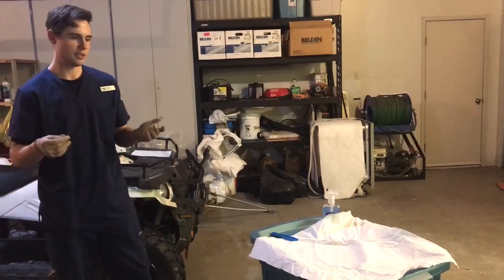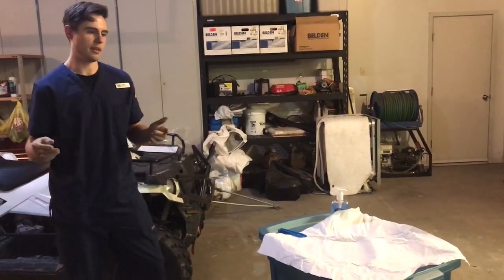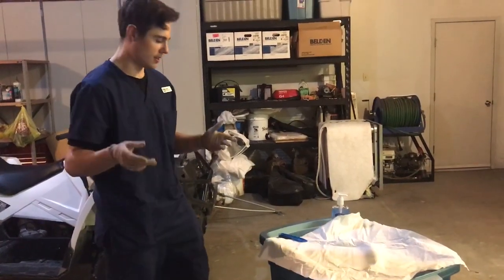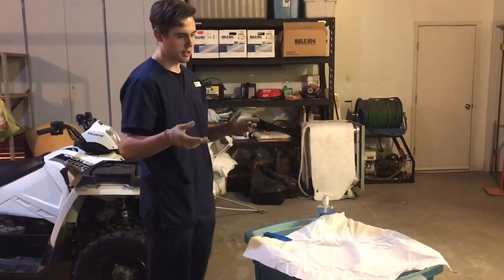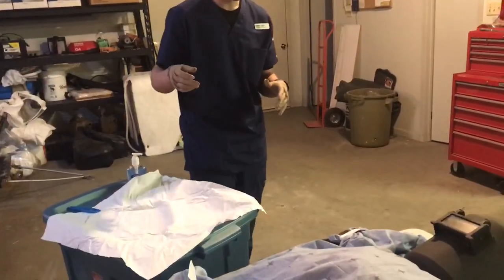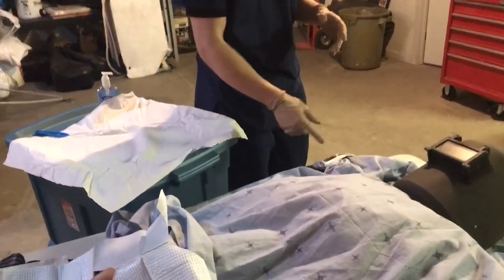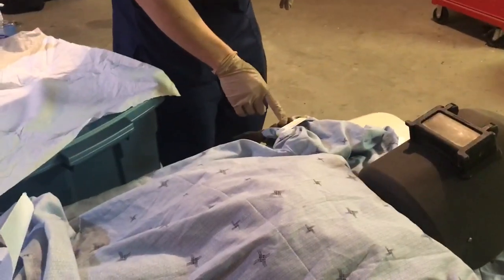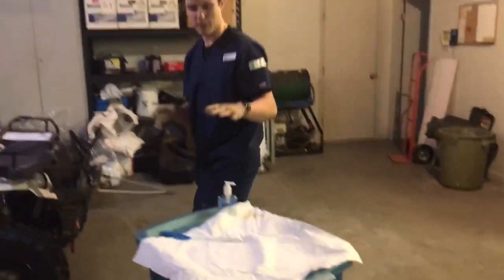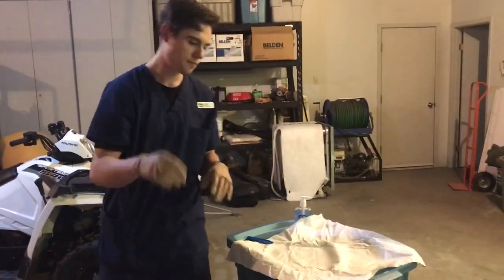Hi, I'm Alex Lesiuk, student nurse, University of Manitoba, and I'm going to be removing your Foley catheter today as per doctor's orders. And could I get your verbal verification of name and birthday? So he will tell me his name and birthday, and I will compare that on the wristband here. So we got Nursing Jake, January 1st, 1960. That's good. And we could ask about allergies at that time as well.